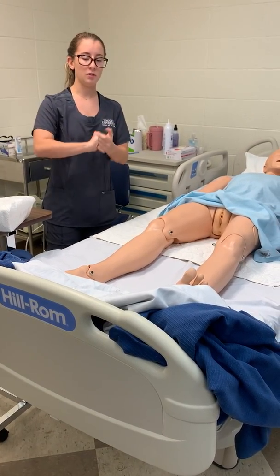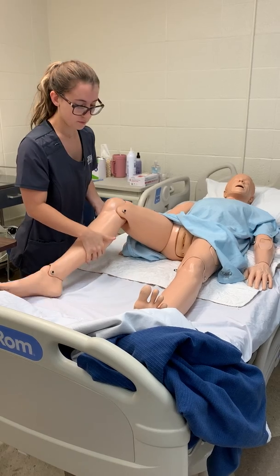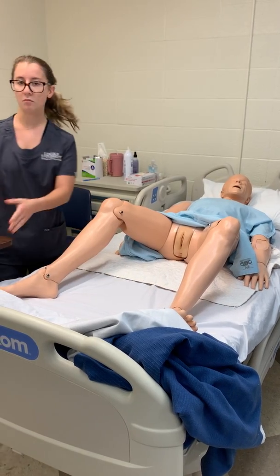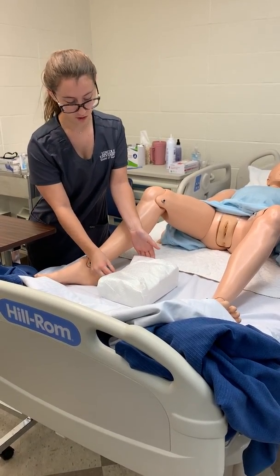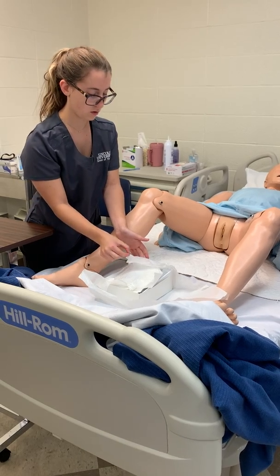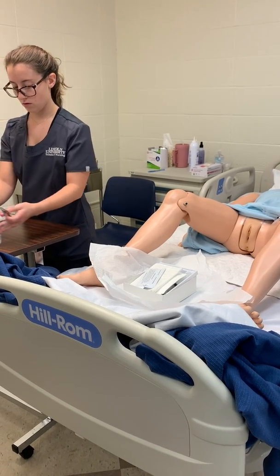And now I'm going to go ahead and position my patient with her legs sprawled in the butterfly position. So I'm going to set my kit in between her legs. And I'll go ahead and open it up. And now I'll go ahead and put on my sterile gloves.